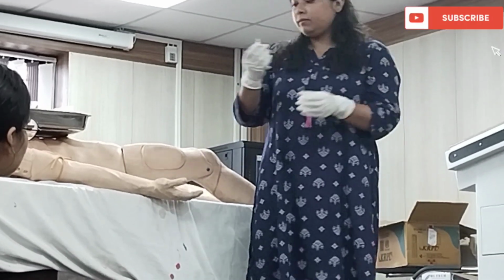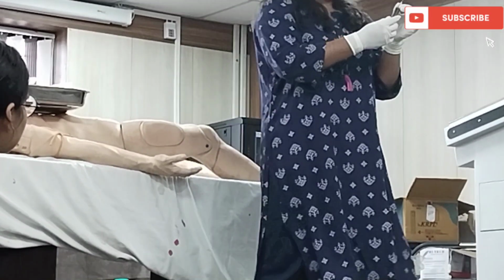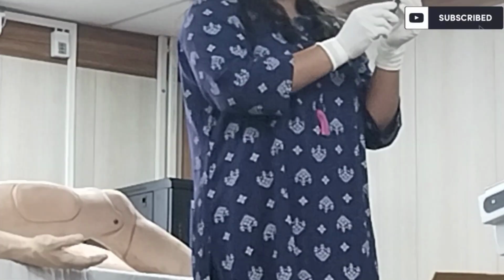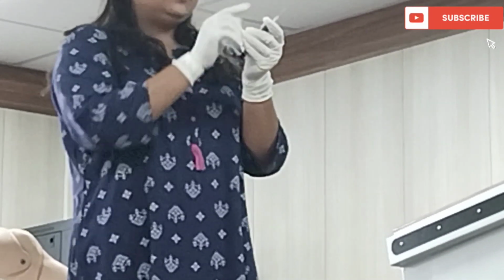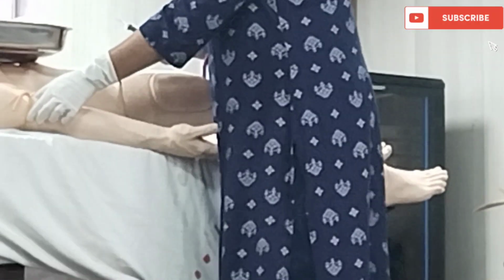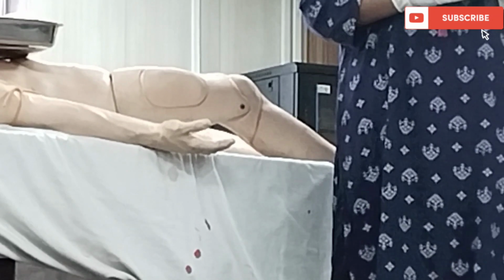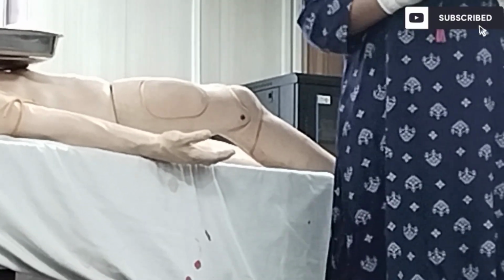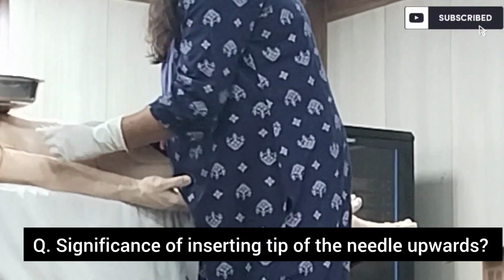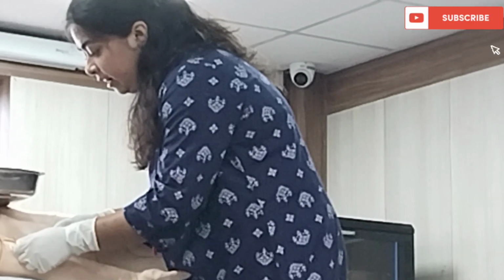After that, see the needle. This needle has a bevel end. While introducing it, in most cases the bevel end will be facing upwards and that will be introduced into the vein first. Yes, that causes less trauma. So the bevel end will be put upwards. After that, we will introduce the needle into the vein.